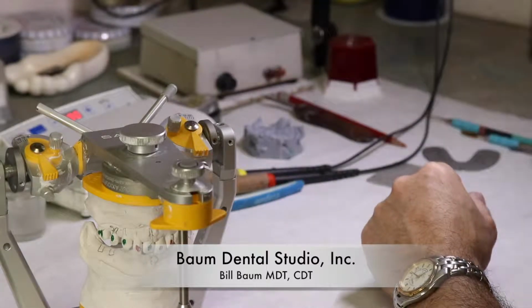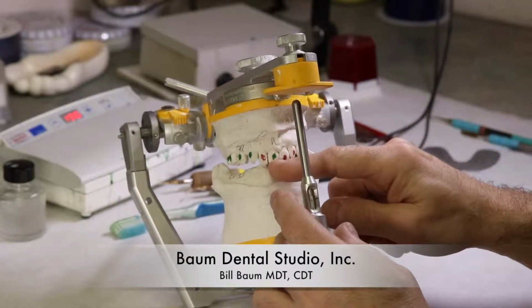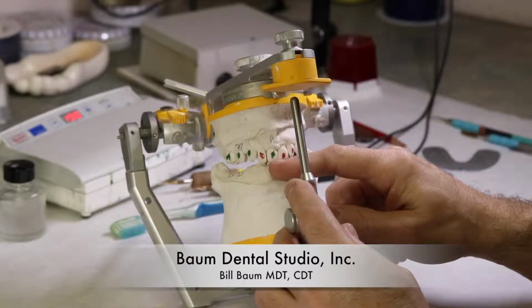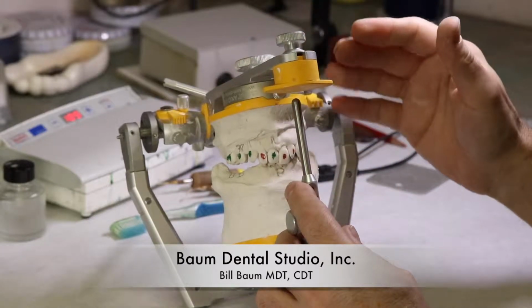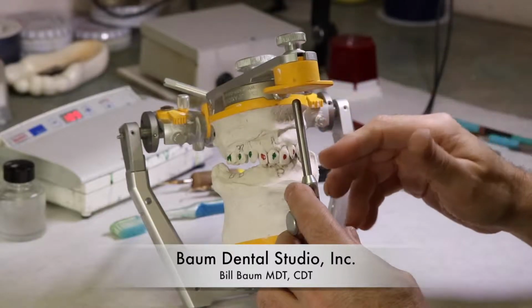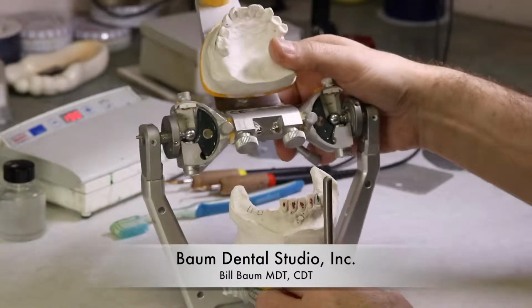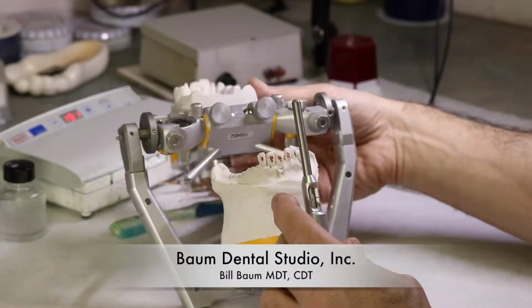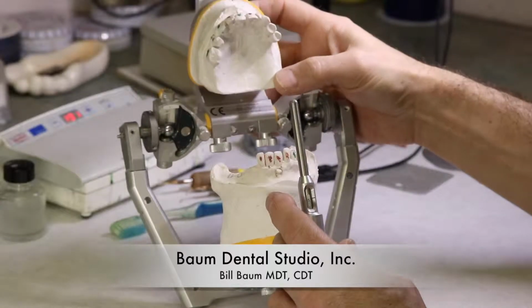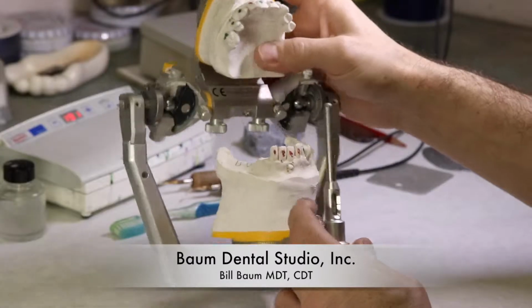So from there, I made indices to record these positions and built my wax up sequentially to incorporate what we know was right. We also utilized the retromolar pads and the hamula notches to try to develop a harmonious occlusal plane.